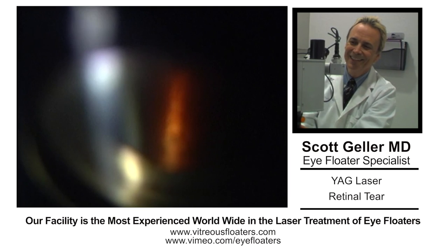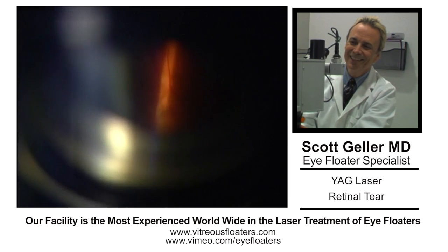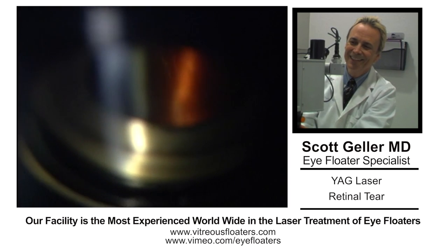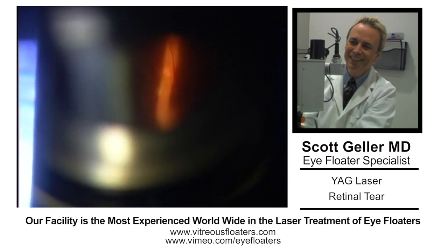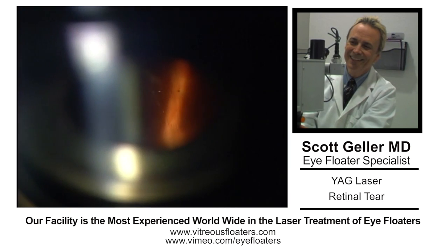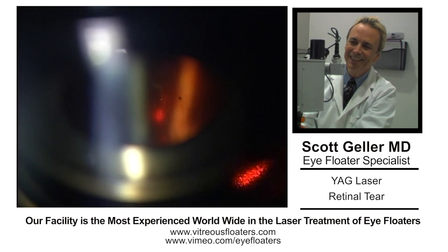This patient came in — it was a young lady — came in for eye floaters, but examination revealed a small retinal tear. I treated it initially with argon laser and sealed it up, but on a follow-up visit inspection, you can see that the tear has a vitreous traction band going to it, about right here.